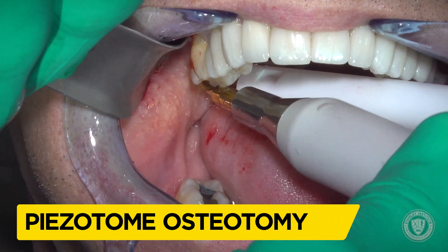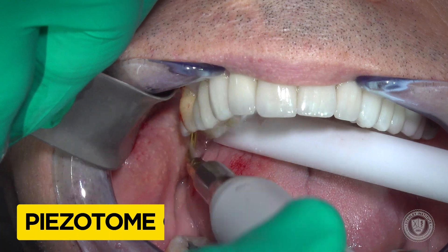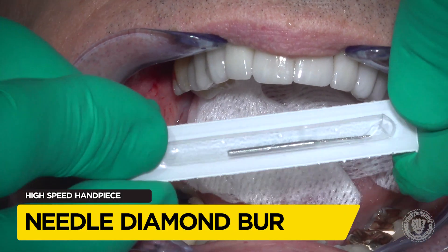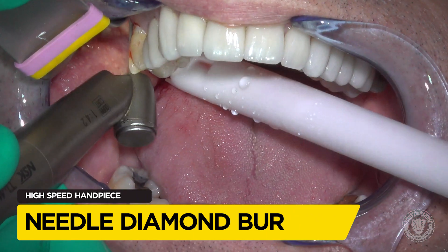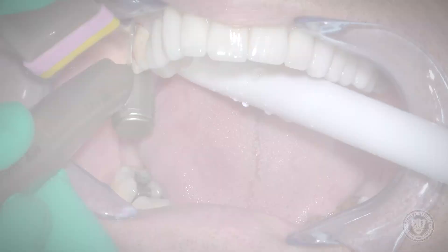The first thing we need to do is retrieve the malpositioned implant. We do that by starting off with a piezo tip — a piezotome tip — followed up with a Brasseler 859 burr, which is a very, very thin diamond burr that's helpful for root tips as well as removing implants.